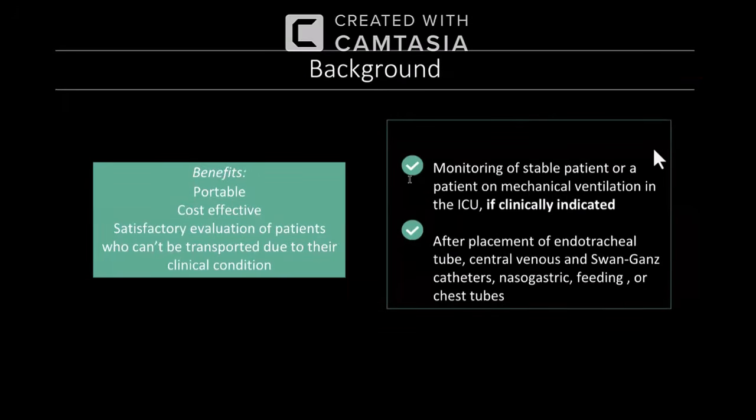All right. So the portable X-rays are a very key aspect. Sometimes you will get at least 1 or 2 cases, or at least 3 cases in the exams. So what are the benefits of portable X-rays? It is cost effective, and it gives a satisfactory evaluation of patients who can't be transported due to their clinical condition, especially in the ICU setup.